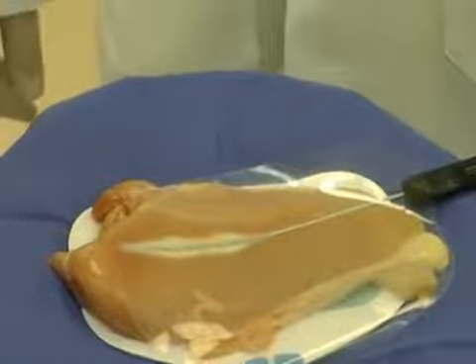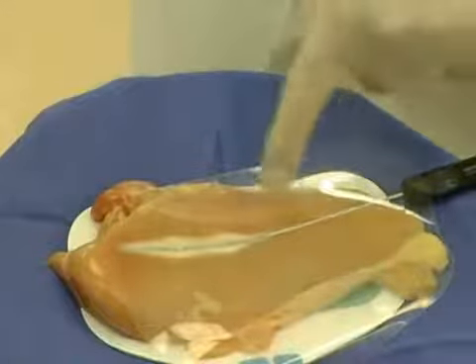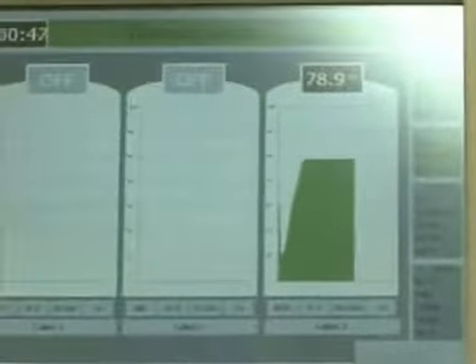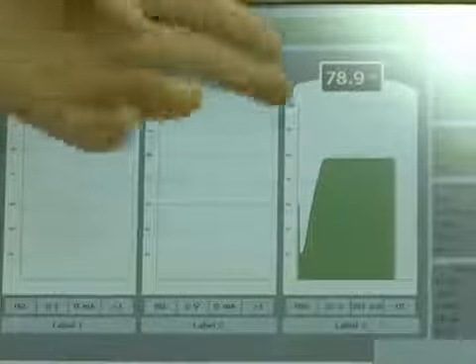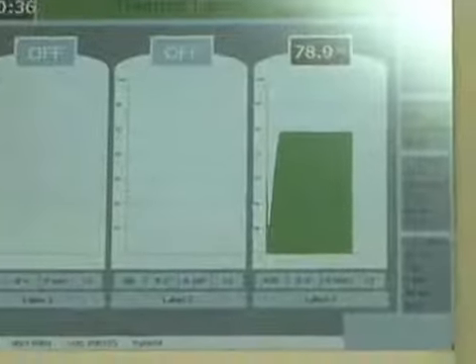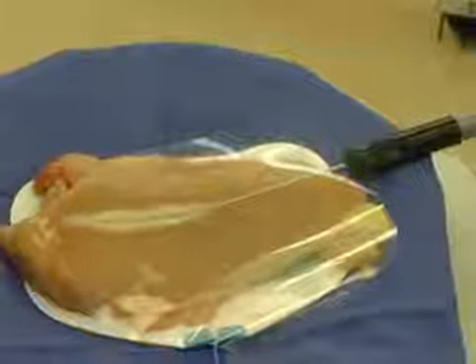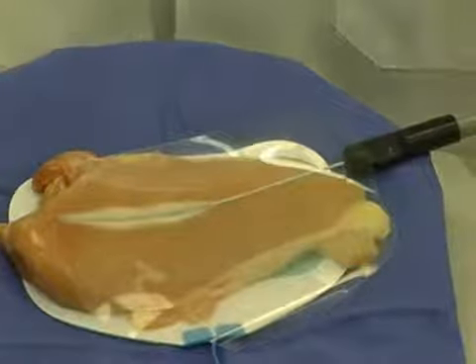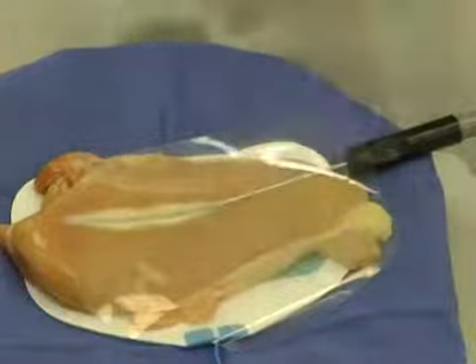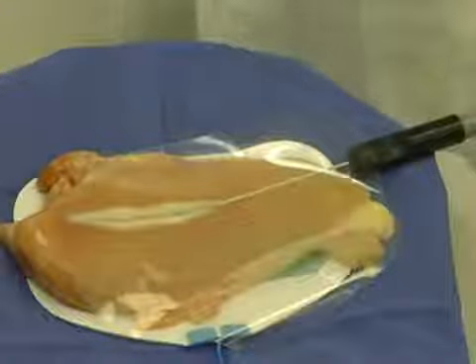Phase 4 is now completed, and we're on the final phase, which is isolated probe 3. Probe 3 is this one, and you'll start to see the ablation forming around the probe. And again, probe 3 heating at 80 degrees for 1 minute. At the completion of this phase, the treatment will be complete. The treatment is now complete. Since each phase was a 1-minute treatment, the total treatment time was 5 minutes. You can see here that we have a very uniform, elliptically shaped ablation that is of significant diameter and depth.